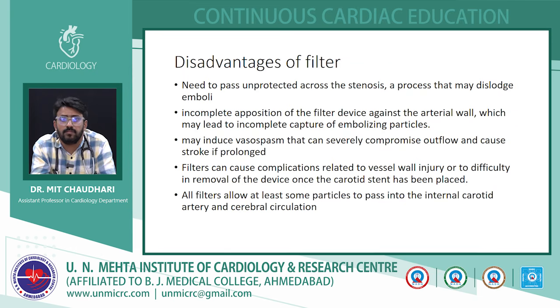Many times the filter can have incomplete apposition. Sometimes the filter itself can cause some vasospasm or damage to the vessel wall, and very rarely it is difficult to retrieve the filter back. So these are some disadvantages of the filter. If during the procedure the filter gets clogged, then you have to aspirate the blood that is proximal to the filter. Next are the disadvantages of the filter.